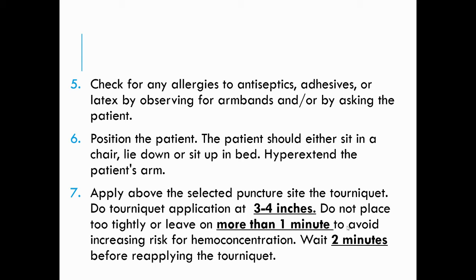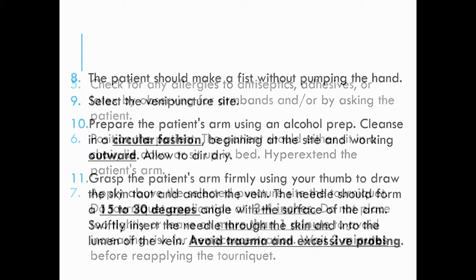we will be using an adapter and different multi-tubes for the evacuated tube system. So we can use many tubes and we are not limited to just 10cc, since one patient may have many laboratory tests requested. That is why you use many tubes instead of transferring blood.